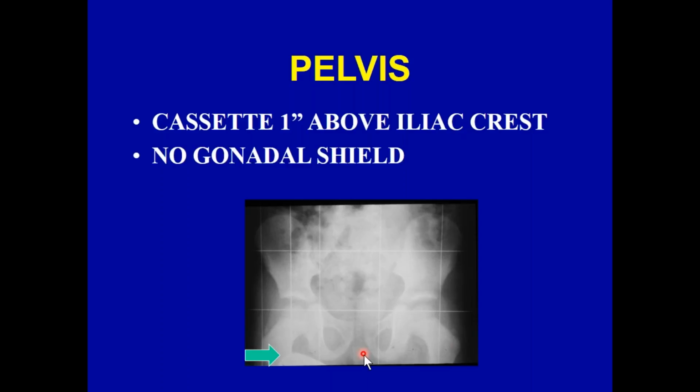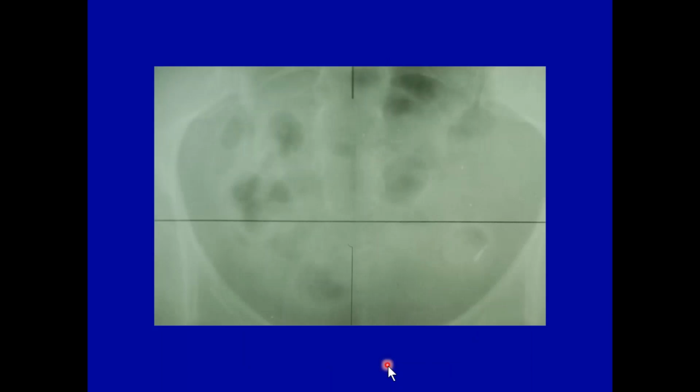Do everything as part of your procedure, and then we will get the lumbosacral junction, both SI joints, so that's number 3, 4 hip, 5 hip, symphysis pubis is 6. So 6 anatomic parts on one x-ray. That's very good yield for the area that you've taken. And where the laser pointer is now, those are the bottom of the ischial tuberosities. So femoral necks, ischial tuberosities. An underutilized x-ray in my mind in the chiropractic profession.